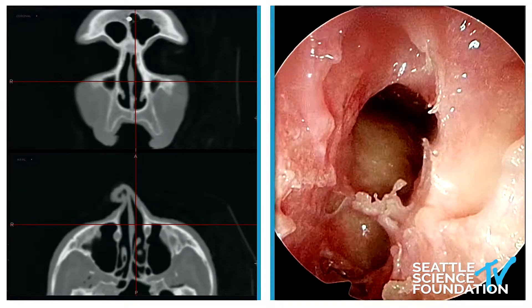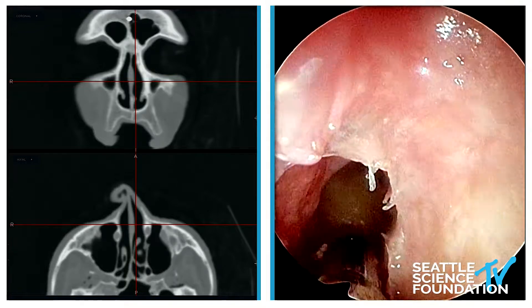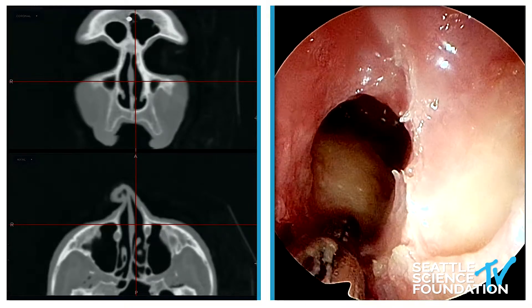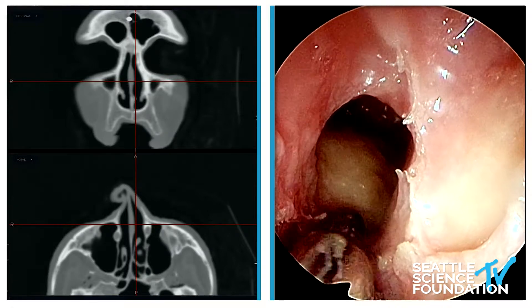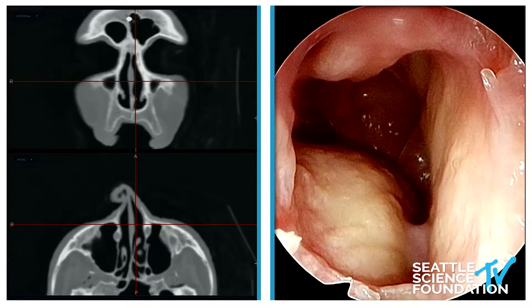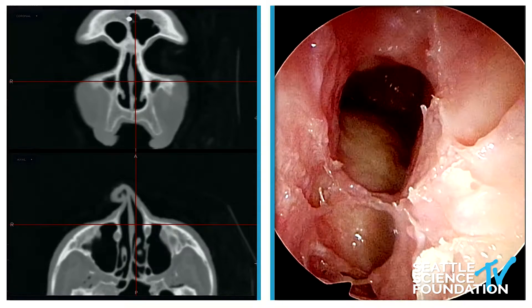So here, anteriorly, the 70-degree scope puts us so that we can see directly up into the frontal sinus — a tool that lets us rotate and be able to cut. Be cautious when you're doing this, because you've got to know where this thing is, because this thing is that triple crown that Winston was going for. And to try to skeletonize that right back creates that appearance of the half horseshoe, the tail of the horseshoe that ends in the anterior ethmoid artery. Seeing right up into the frontal sinus with a 70-degree scope lets us determine if we've gotten all that thick sludge and allergic fungal mucin that Jeff was talking about yesterday out of it.